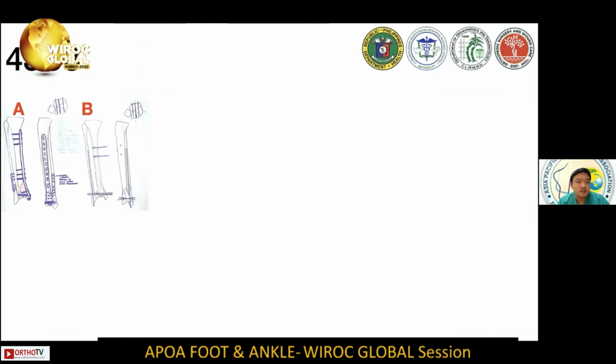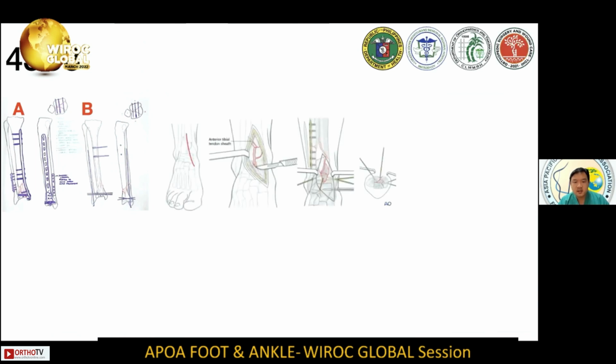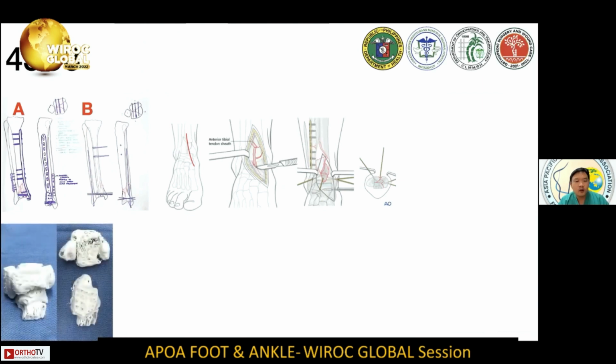So you have a long medial plate. You also have a plate and screw construct for the lateral malleolus. Plan B, you can see an intramedullary pin and a construct for a hybrid external fixator. These are the approaches he considered based on textbook. We follow a few textbooks as prescribed text here in the Philippines.